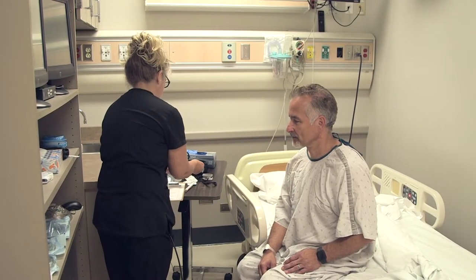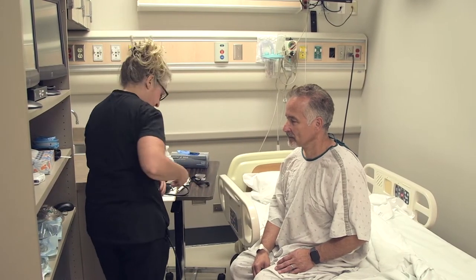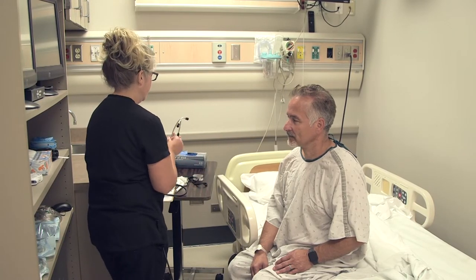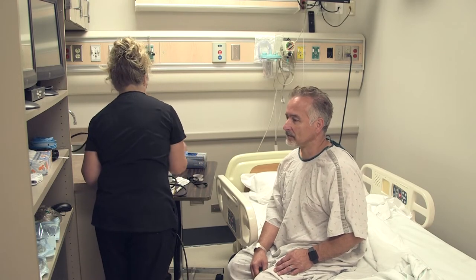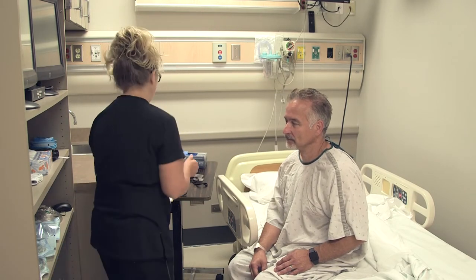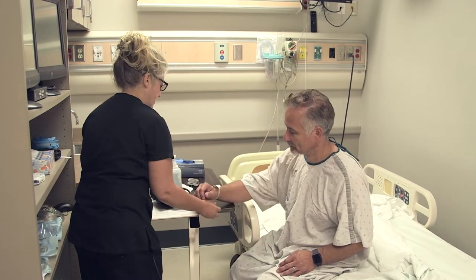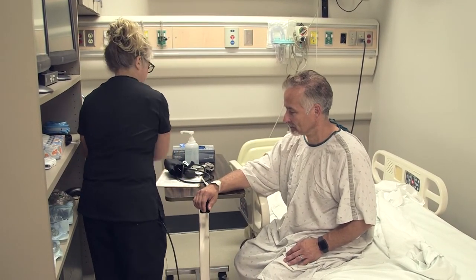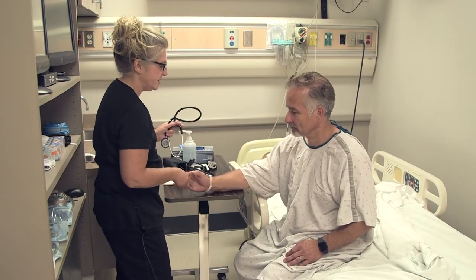All right, the next thing we're going to do then is we're going to check your blood pressure. All right, so I'm just going to get this out. And I'm going to get my stethoscope out here. Just going to clean that as well. Okay. All right, we're just going to get this out of the way. Toss that in the garbage. All right, very good. Okay, Tim, so I'm going to have you rest your arm right on this table here. I'll just move things around a little bit so we can fit. All right, very good.